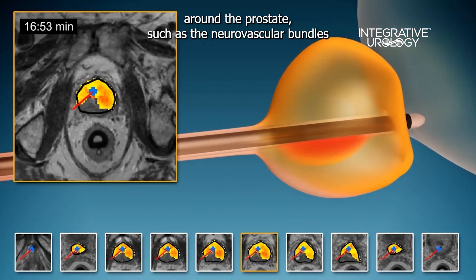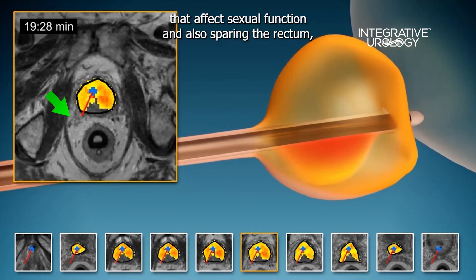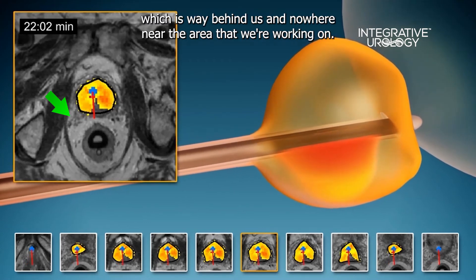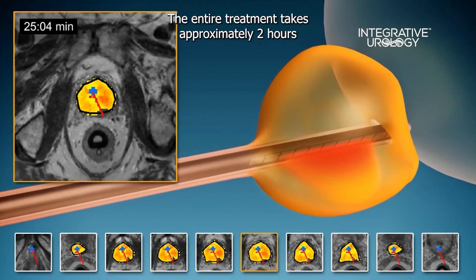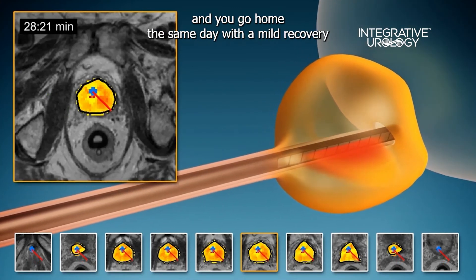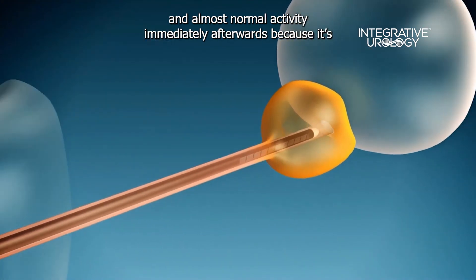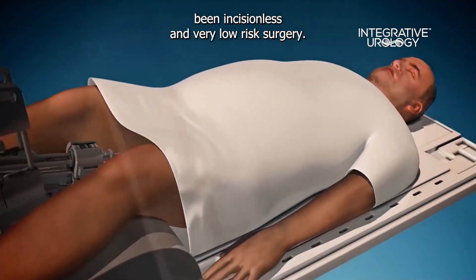The rest of the structures around the prostate, such as the neurovascular bundles that affect sexual function, are spared, and we're also sparing the rectum, which is well behind us and nowhere near the area that we're working on. The entire treatment takes approximately two hours, and you go home the same day with a mild recovery and almost normal activity immediately afterwards, because it's been incisionless and very low risk surgery.